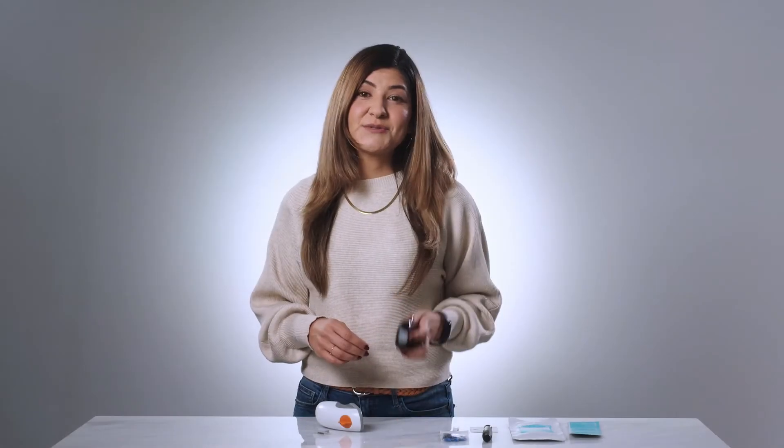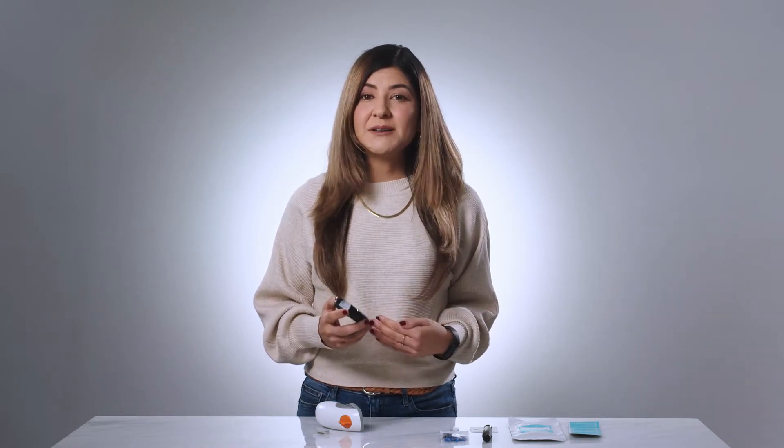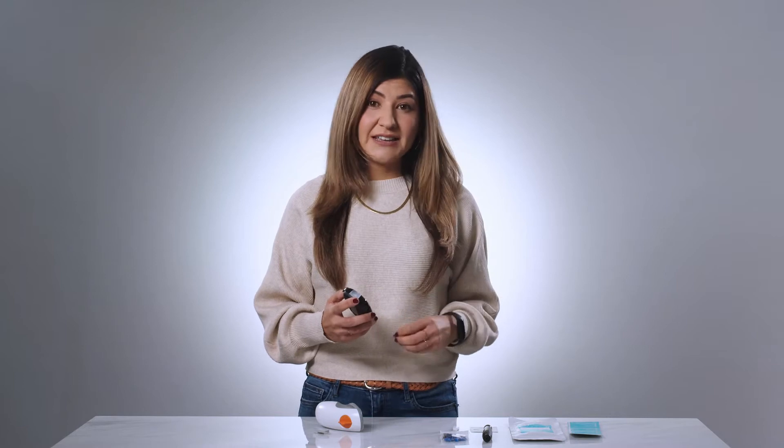The ketone meter is the sensor you'll use for the shortest amount of time — we only require it for the first 10 to 14 days of the program. However, collecting ketone data is important, particularly if you are currently taking insulin, to make sure your body has enough fuel. We need to make sure your diet helps you create ketones, just not too many ketones. Getting healthy is always a balancing act. Measuring your ketones will help us see where you are on any given day so we can give you nutrition guidance that helps you achieve an effective ketone level.